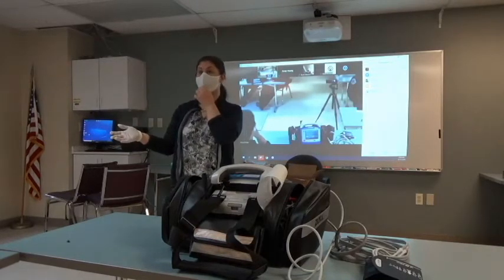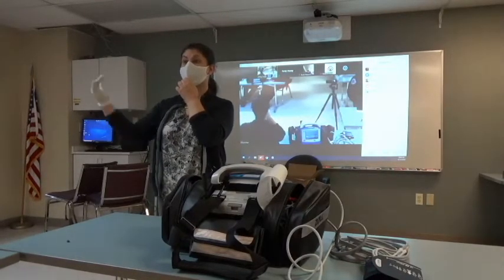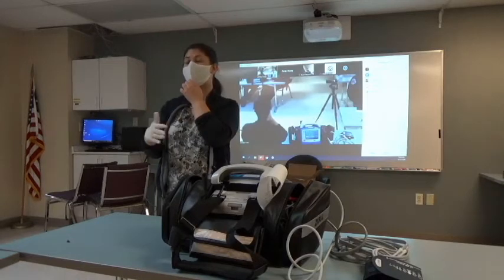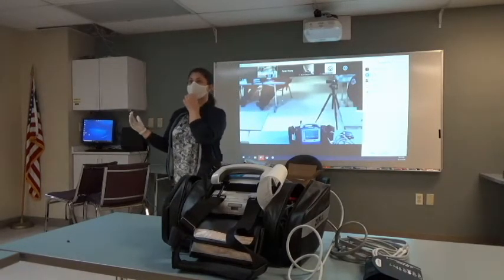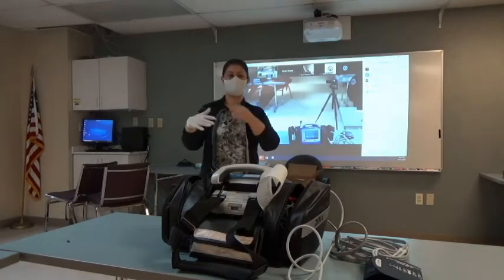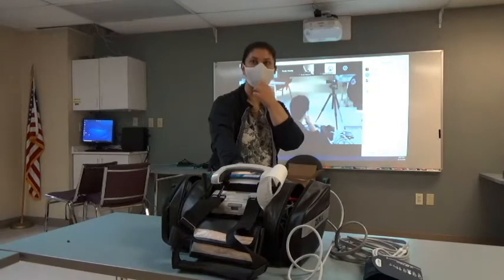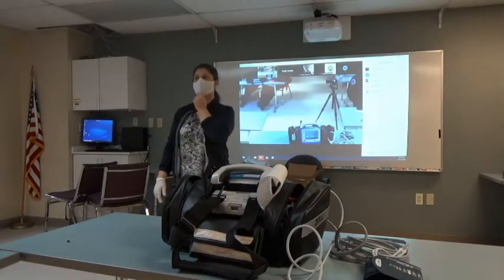So you might get erroneous readings because you're introducing that into the line when the patient starts to breathe in. And that's not specific to Zoll, that's on any device. So it's kind of like a free air check before you put it on the patient. Yeah, so just make sure that this allows it to go through, it zeroes out on its own, and then attach it to the patient.